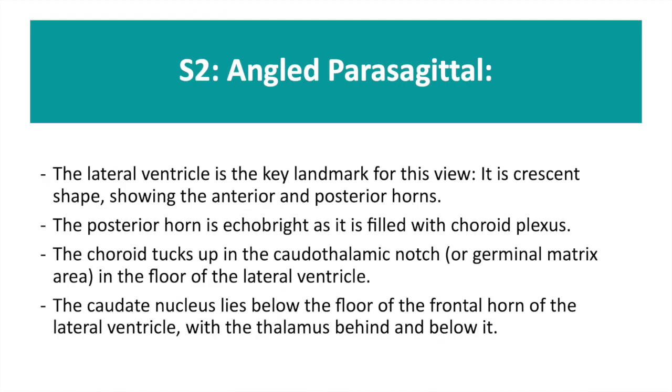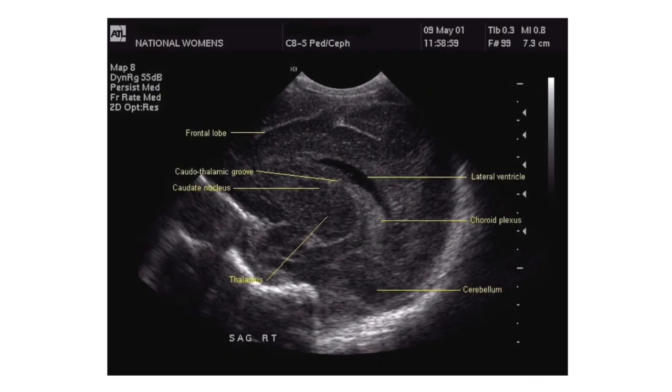By angling your probe slightly right or left, you will get the right or left angled parasagittal view, S2. The crescent lateral ventricle is a landmark for this view. You can see the bright choroid plexus in the posterior horn of the lateral ventricle, and at the top of this, you can see where it tucks up into the caudothalamic notch.